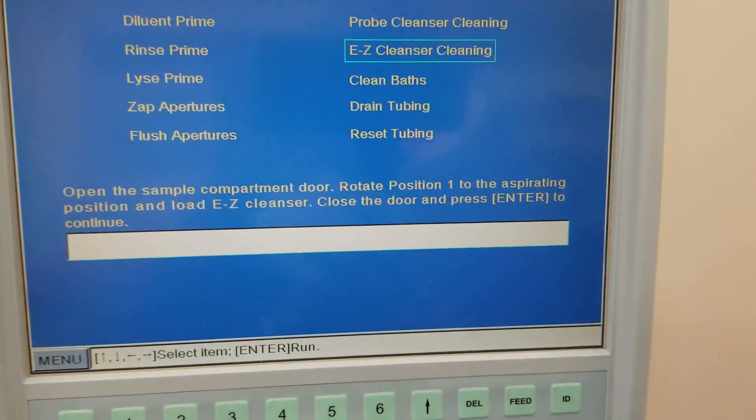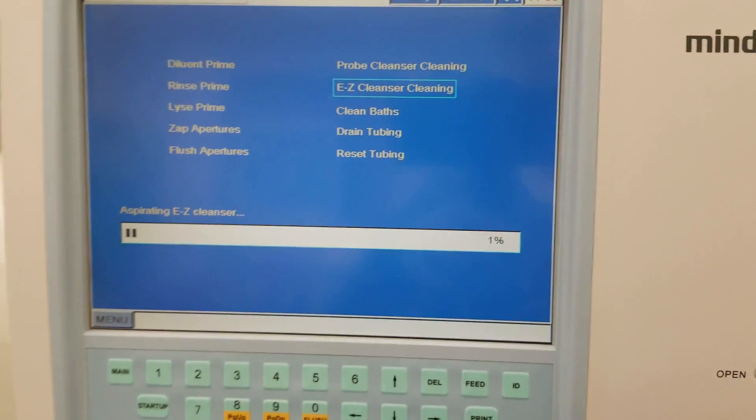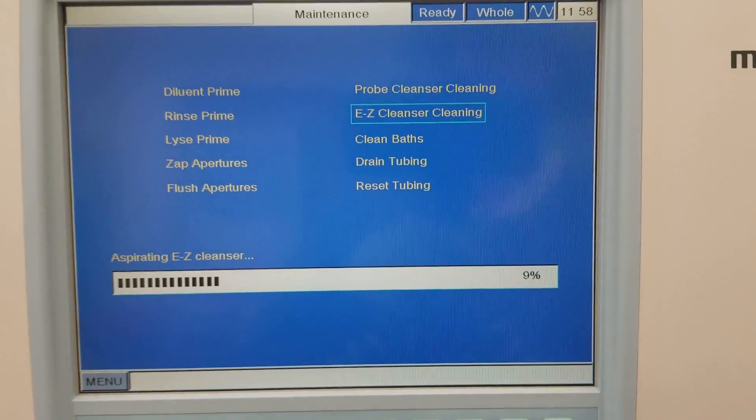Make sure you read all of this first before you do it, because if you press Enter too early it's going to suck up air and that's not going to be good. This is going to be an eight-hour process, so this should be done after class.